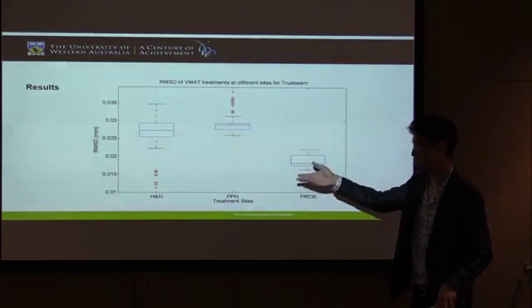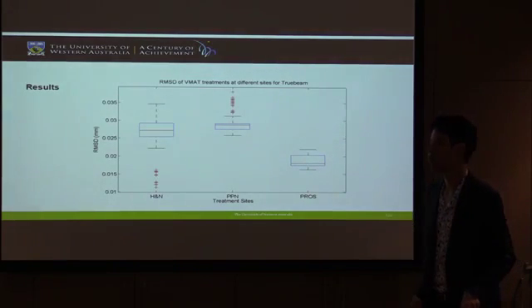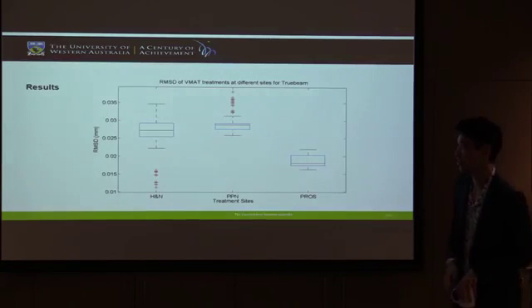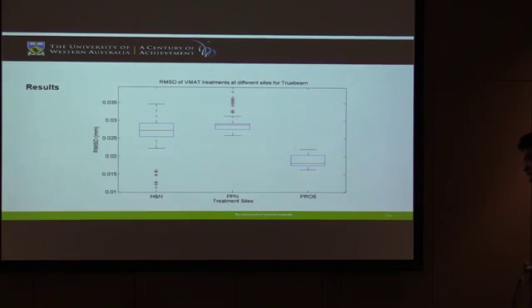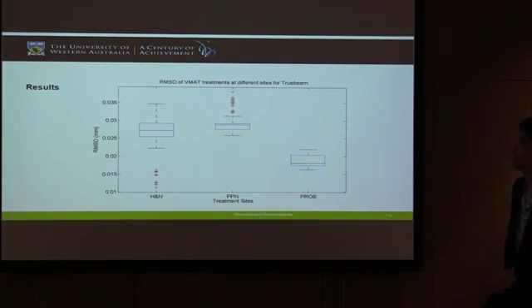There are like 700 head and neck treatments, so there are 700 points there, each representing the error of one treatment. I just find it interesting, that's all. Head and neck and prostate pelvic node have a greater error than prostate, but I guess that's what you expect, given that prostate is a less complicated treatment to perform. I just thought that was cool.